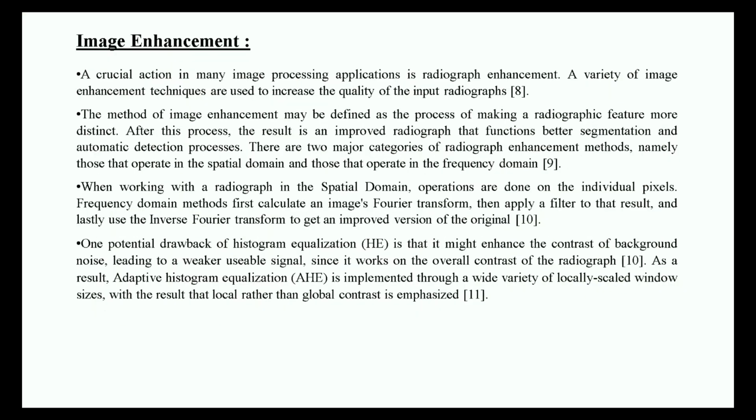Image enhancement is a crucial action in many image processing applications, and radiograph enhancement is one of them. A variety of image enhancement techniques are used to increase the quality of the input radiograph. A radiograph is an image. The method of image enhancement may be defined as a process of making a radiographic feature more distinct. After this process, the improved radiograph allows better segmentation and automatic detection.